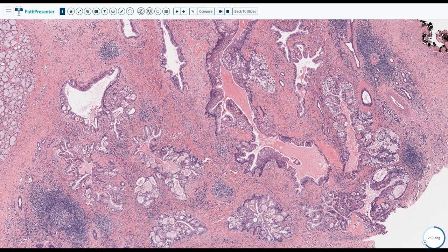It's very common in the exam. And I remember in my board, they gave me a slide with trachea and a lesion arising from the trachea, and it was a mucoepidermoid carcinoma. It was very cool. I could barely swallow during the exam, but I really enjoyed it. So this is mucoepidermoid carcinoma. All right, let's go with the next one if there is no question.